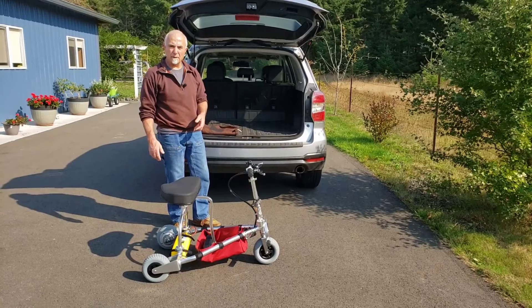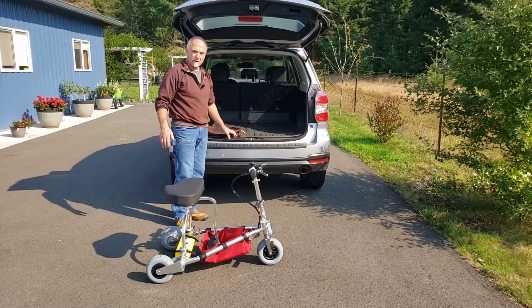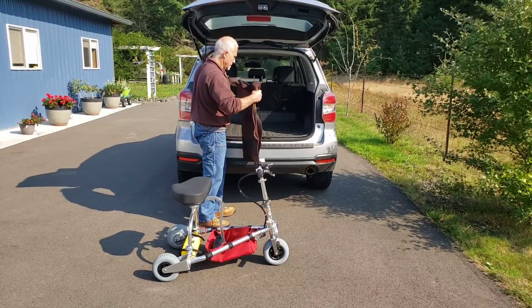If you have difficulty loading it into a relatively high trunk, or in this case a cargo area on a hatchback, there are a couple of tricks. We'll show you one of the simpler ones that many of our customers have shown us. We recommend taking a blanket or something to protect your rear bumper, and then proceed as follows.